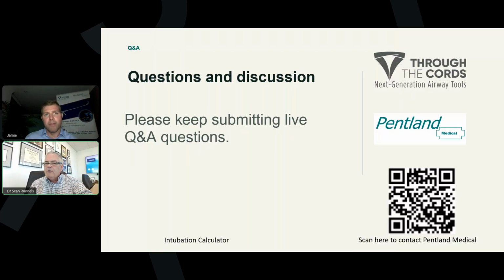So single operator intubation, as the video shows, means nobody's holding the TCI. In fact, there was somebody holding the tip of it back there. You couldn't see it off camera. One of the anesthesia techs was. You absolutely want to control the catheter as you advance the tube. And so it isn't a pure single operator technique, but it's a skilled operator technique.